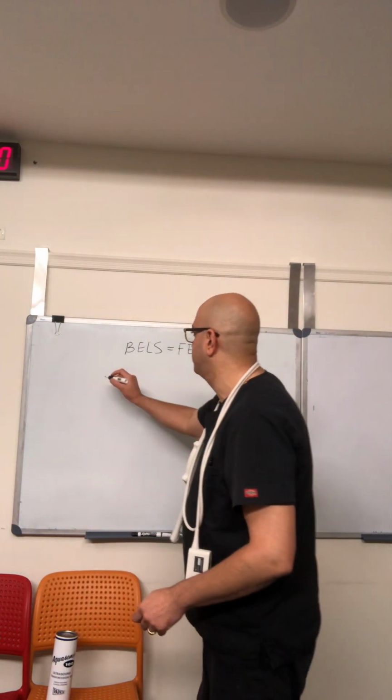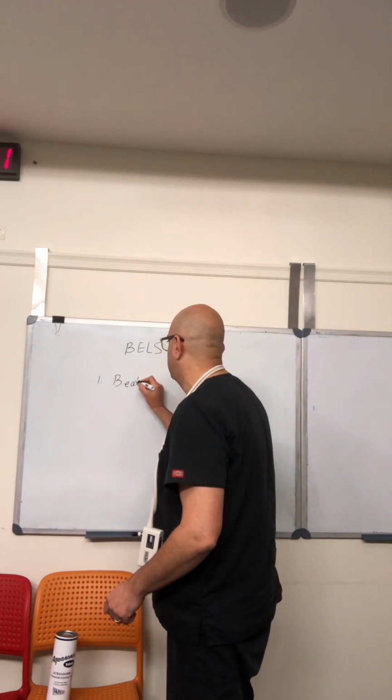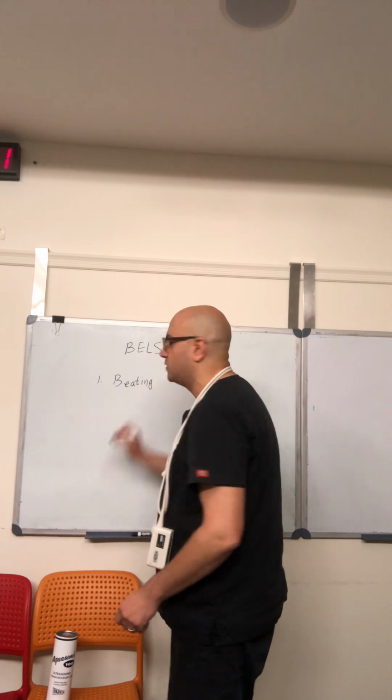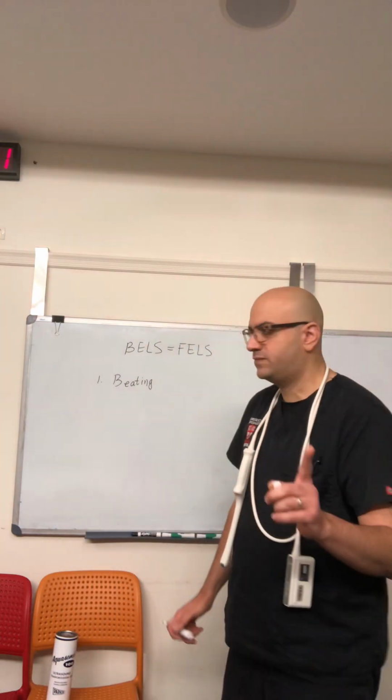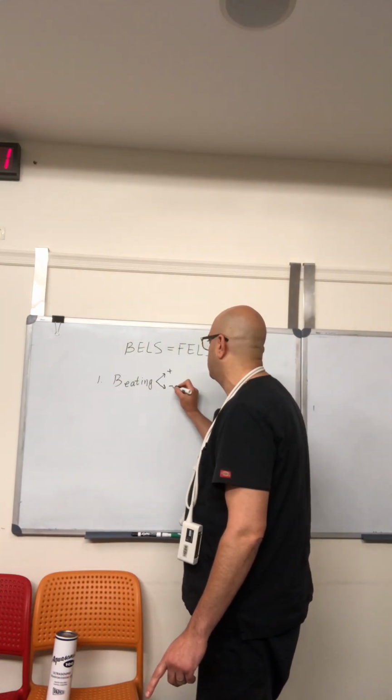Number 1, is there anything beating? Yes or no? For many of us, it's a very difficult question to answer. The patient is coming into cardiac arrest and everyone is checking the pulse, they're in PEA, is there a pulse, yes, no. Putting an ultrasound on, is there any organized cardiac activity? So first things first, beating, yes, no. That's a yes, no question.